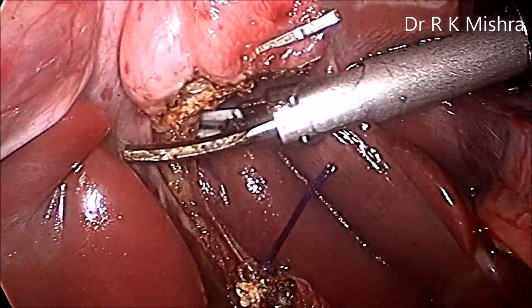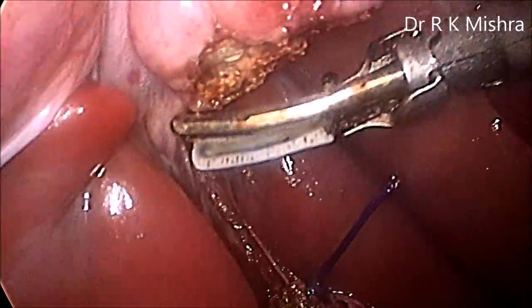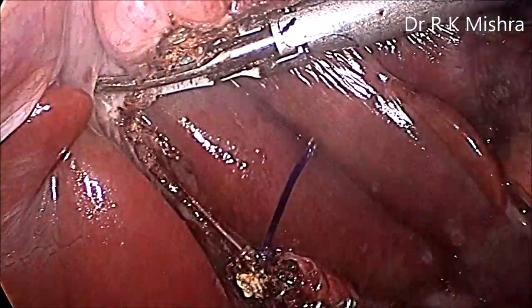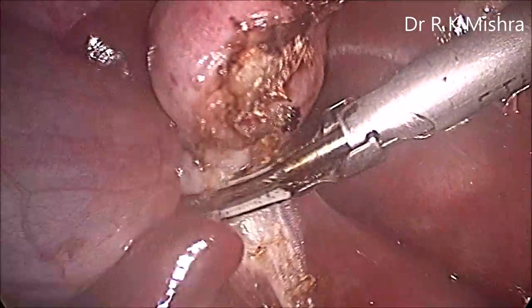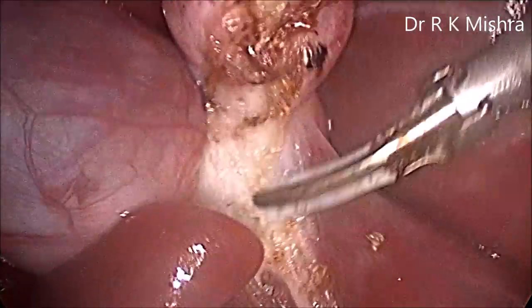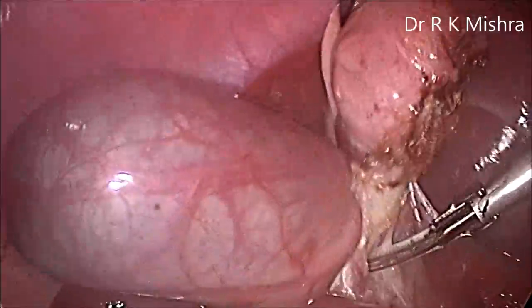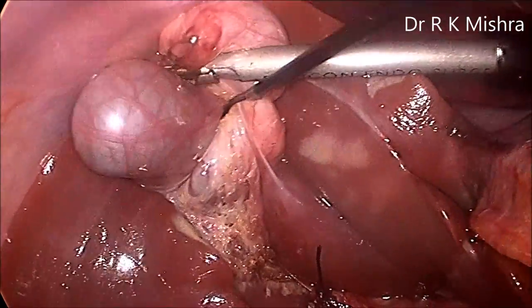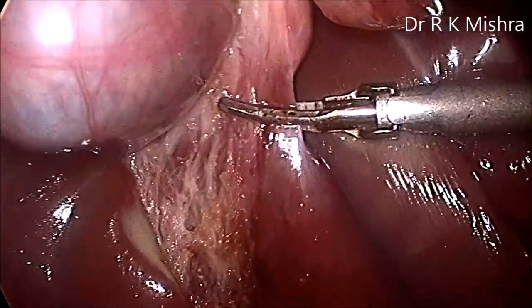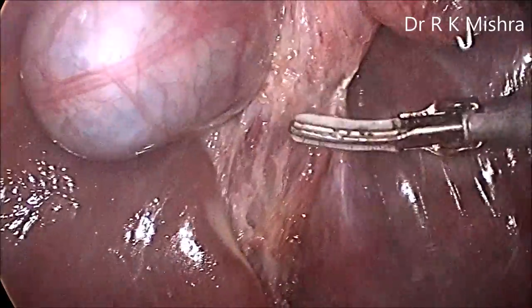Now it is separated, and we proceed to separate the gallbladder from the liver. The left hand must give anteromedial and anterolateral traction because we don't have a third or fourth instrument. The Striker mini alligator cannot be repeatedly opened and rearranged, so you have to be a little compromised and the anteromedial traction must be given carefully. The light cable is kept at the six o'clock position and slowly a good areolar plane has to be achieved.